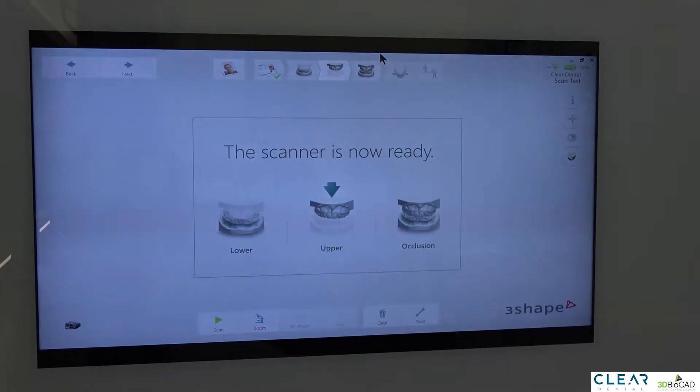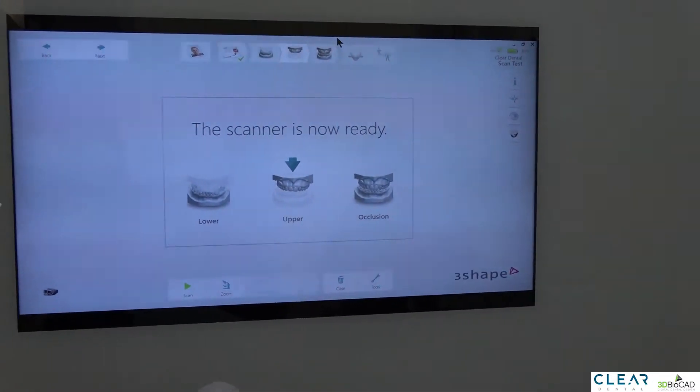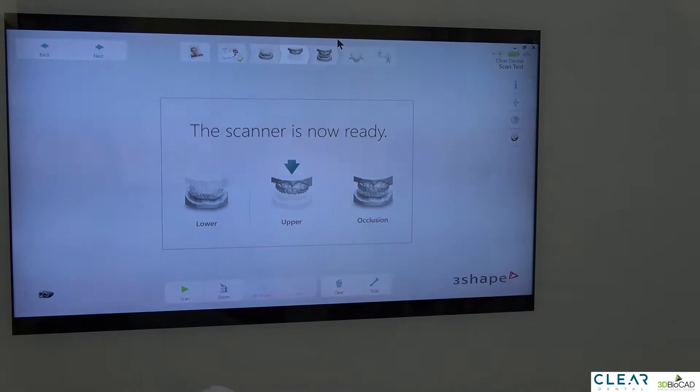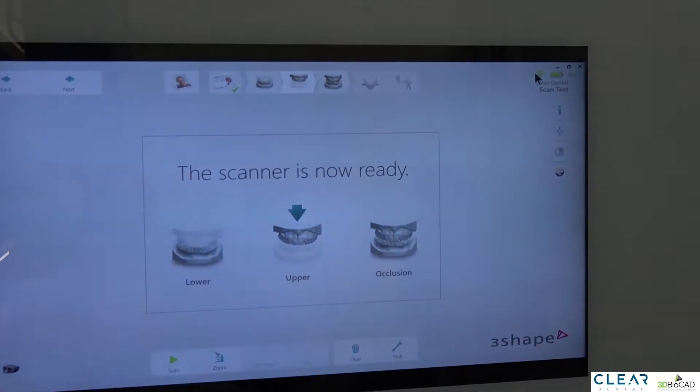This way, while we are scanning the patient, we can actually see what's being scanned in the 6 o'clock position. If you're already a TRIOS user, you'll notice that on the top right corner there are two new icons.